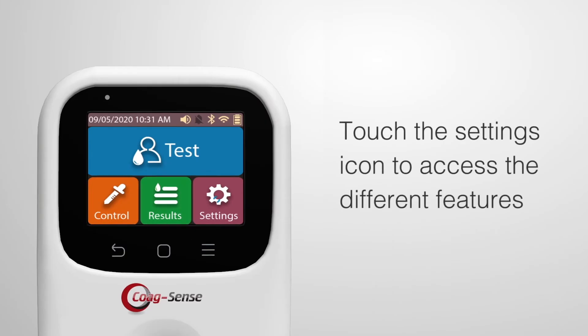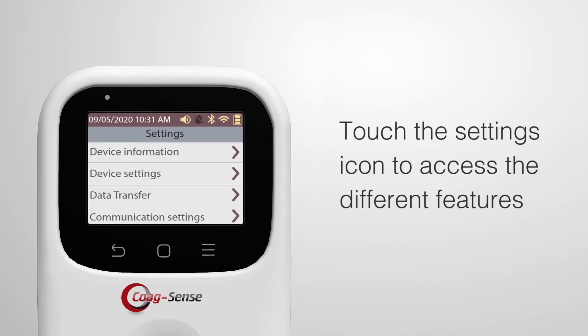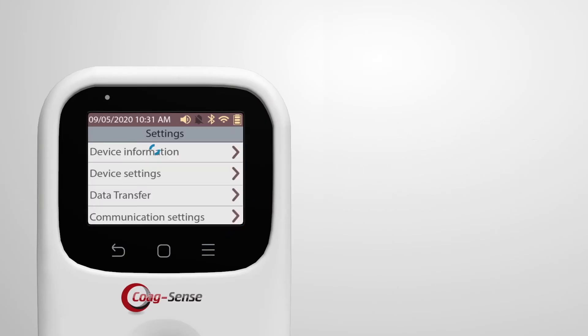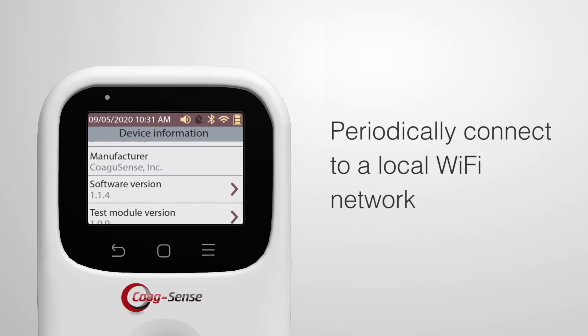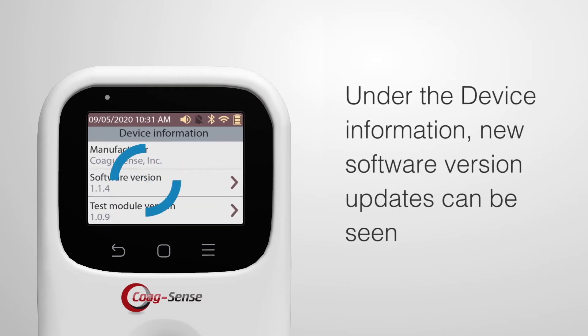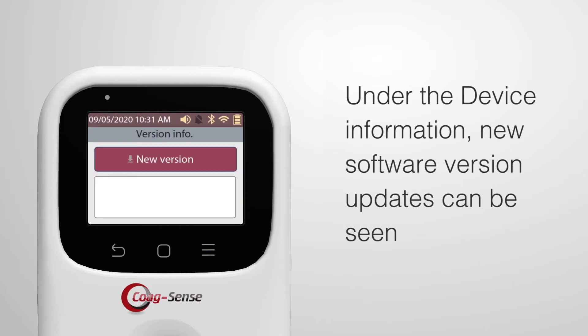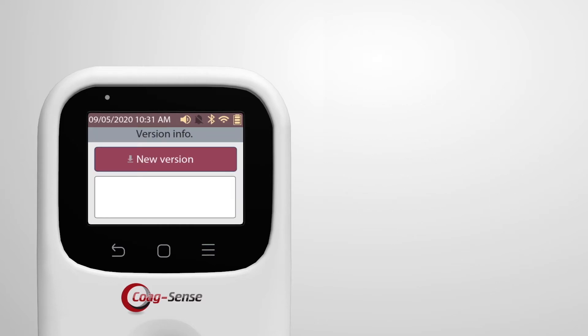Touch the Settings icon to access the different features. It is a good practice to periodically connect to a local Wi-Fi network so that under the device information, new software version updates can be seen.